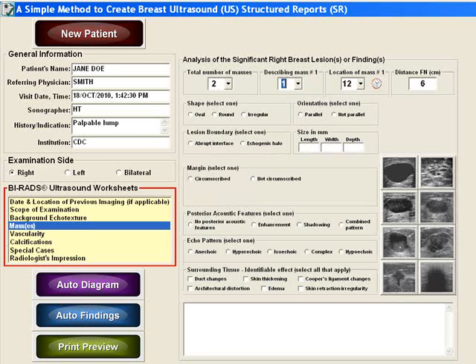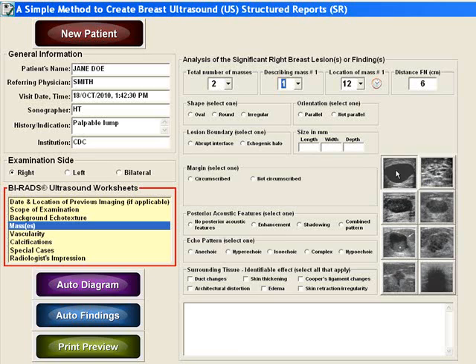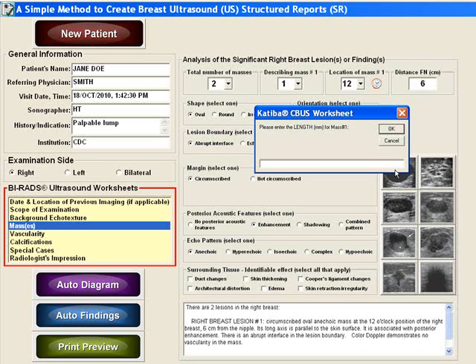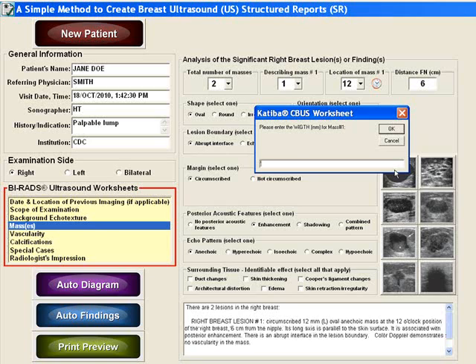Let's assume that the first of the two masses is a simple cyst. An easy way to record this information is to select the simple cyst icon. Now enter in the dimensions for this particular cyst.